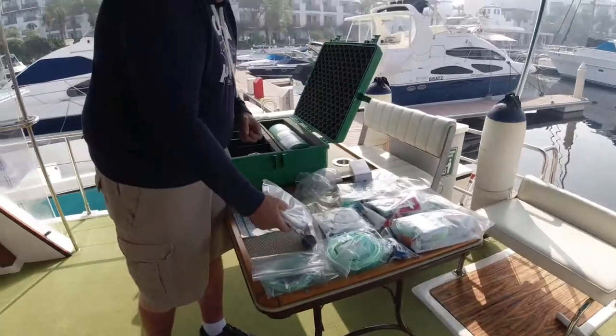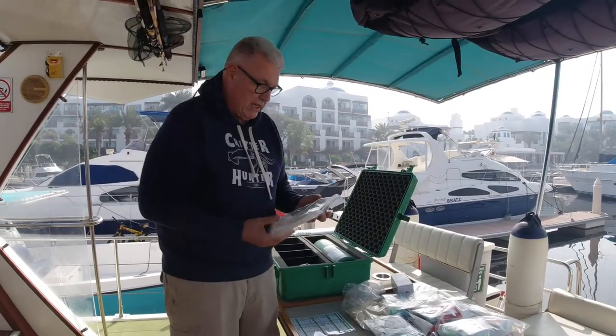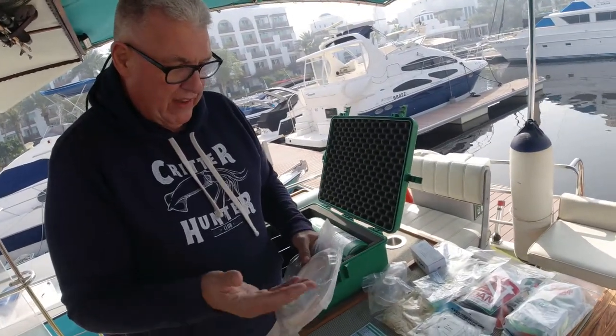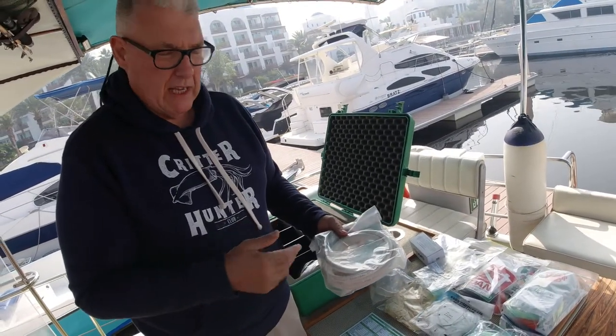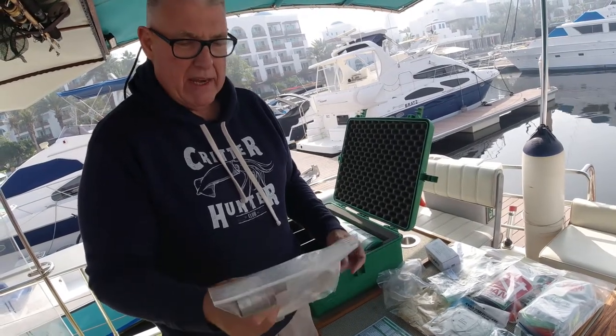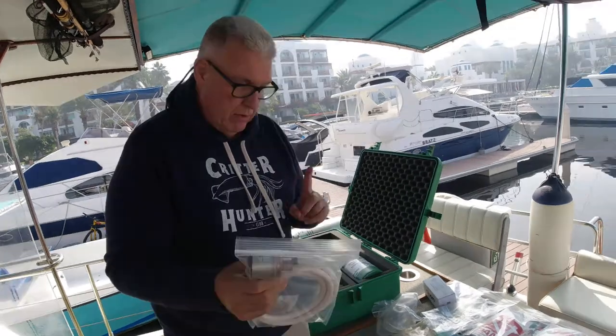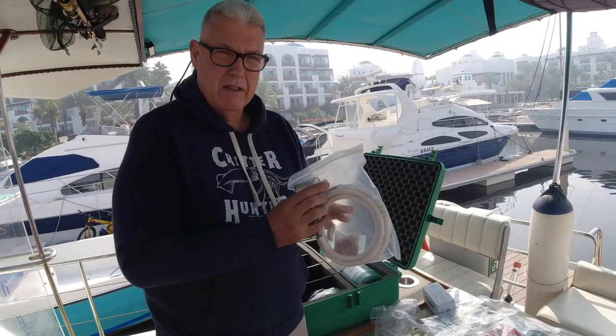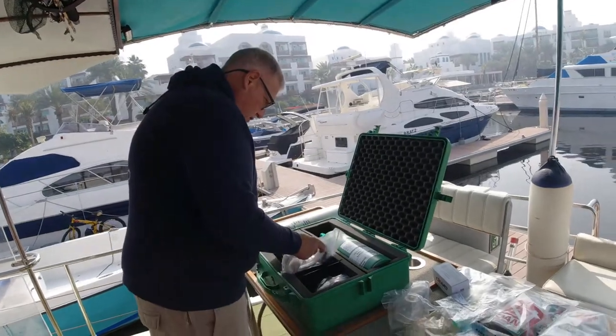Let's talk about the demand valve. I'm not going to take it out but it's there ready to use. When we fix it to the first stage we only do it finger-tight and it can be done very quickly. I think it's better to keep it separate. That goes in the box.